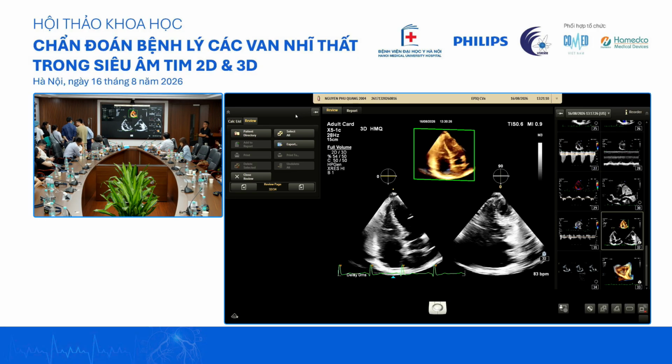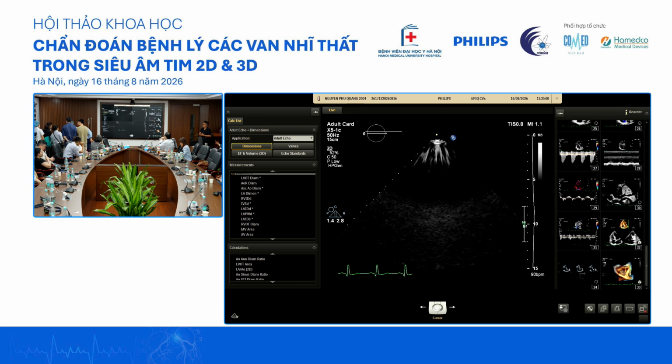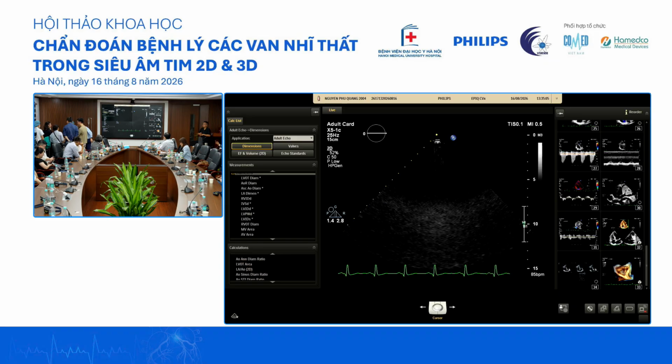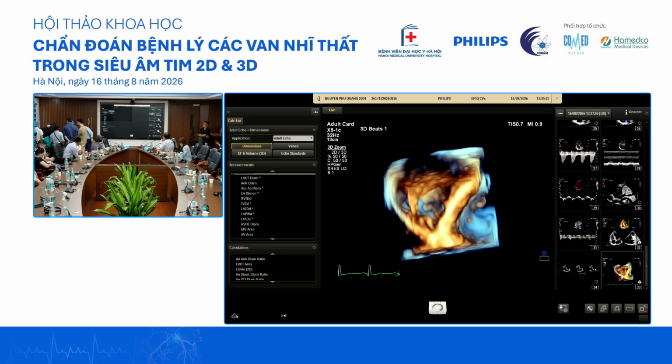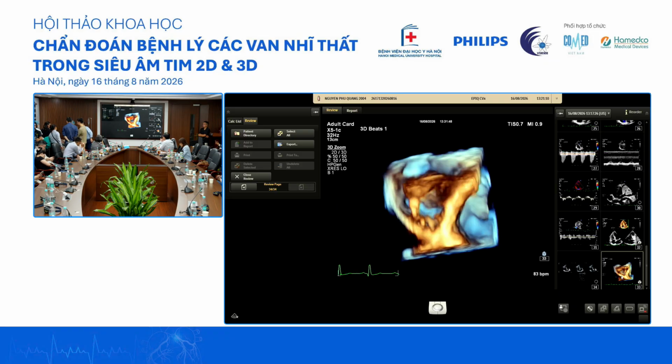This is a primary RV dysfunction. Just now when you went to the 3D tracker speed bar, can you turn on your color? I didn't get the color in 3D. Just now you went to 3D. Yes, and you can go back to the 3D one, and when you turn on color, we go back. You can retake the image.